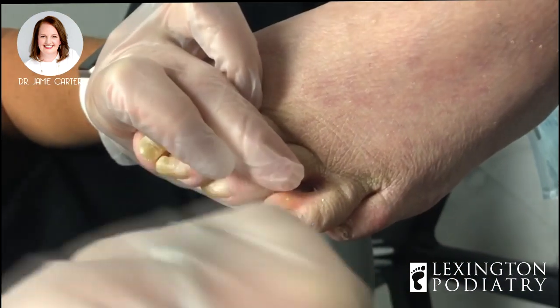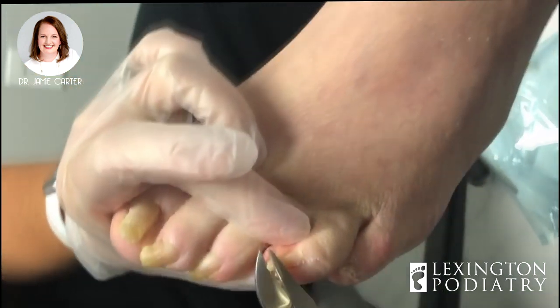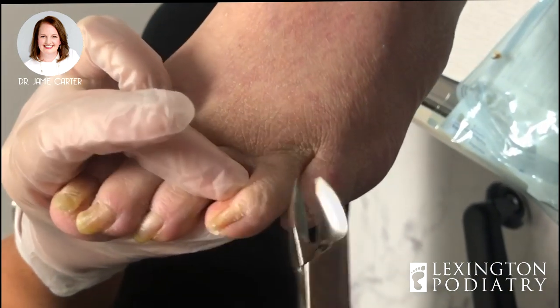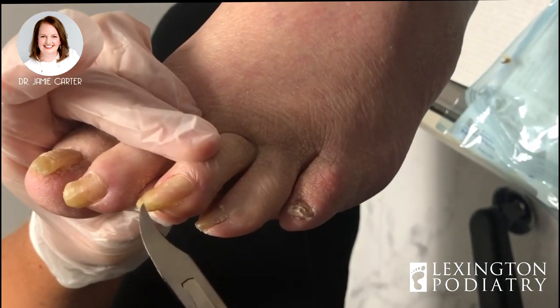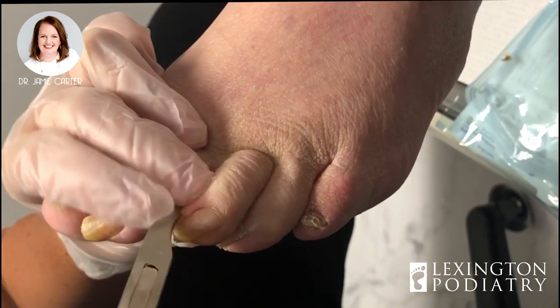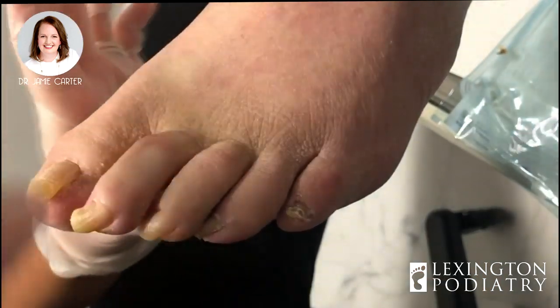That's pretty normal — even sometimes it's hard for us to tell what's skin and what's toenail. But we do have a much better angle sitting down here at his feet, and we have lots of experience and really good instruments. That's why it's a much better idea to let us do it right. He's hopefully going to feel like a brand new man when we're done.